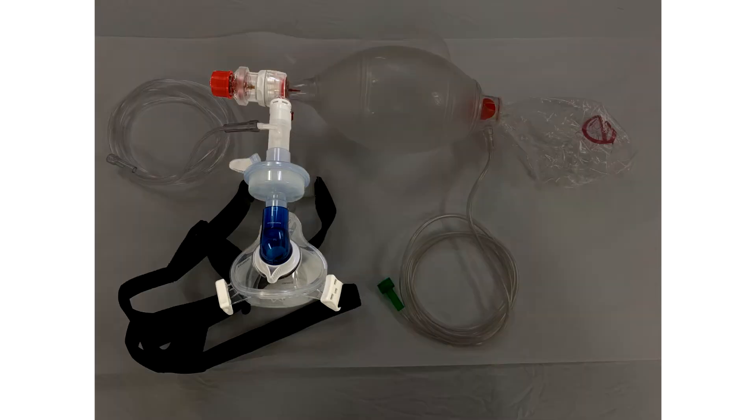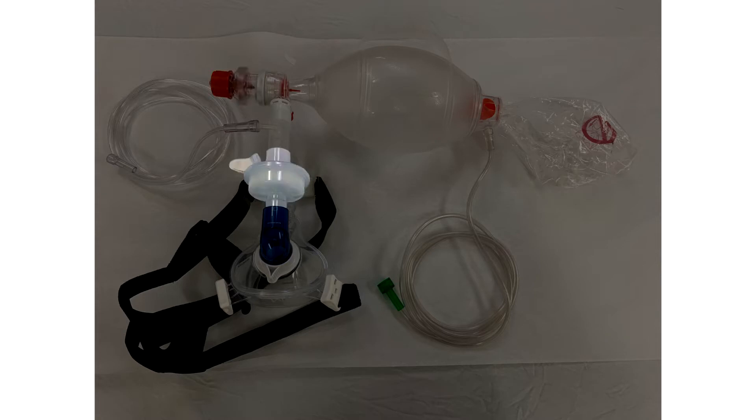Here's the mask. The distal portion is a bit complex, so we're going to walk through it. You have a PEEP valve, you have a viral filter, and you have a CPAP mask. We're going to chat about the extra parts a little later.